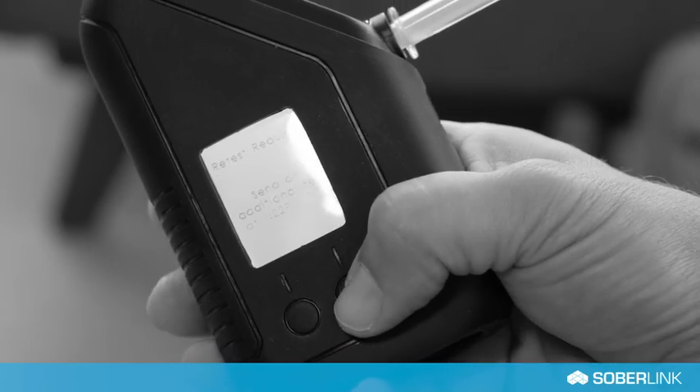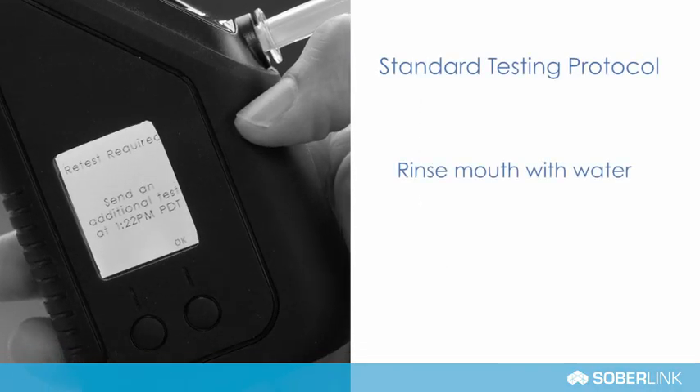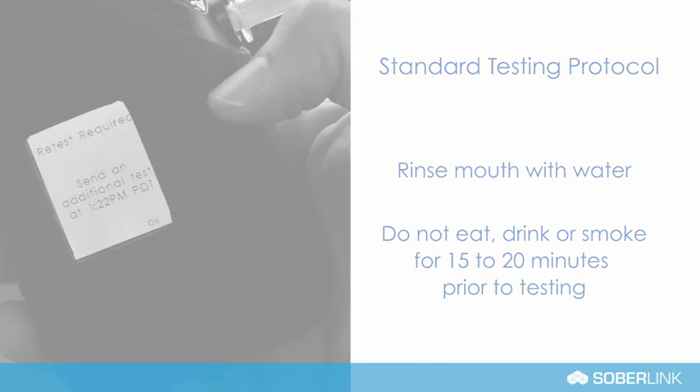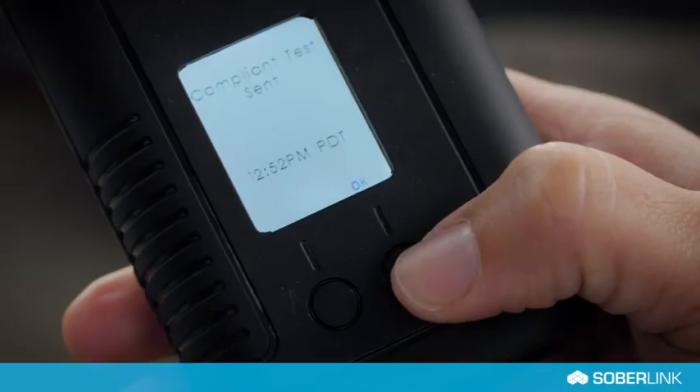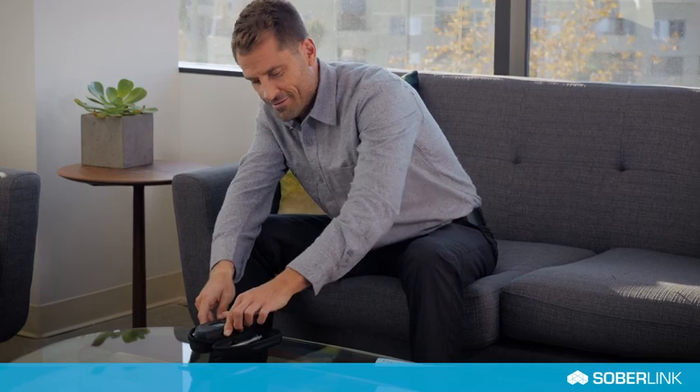During the 15 minutes, Soberlink recommends repeating the standard protocol for testing: rinsing mouth with water, and refrain from eating, drinking, or smoking prior to testing. Lastly, after a compliant test is sent and received, press the right display button under OK to turn off the device.